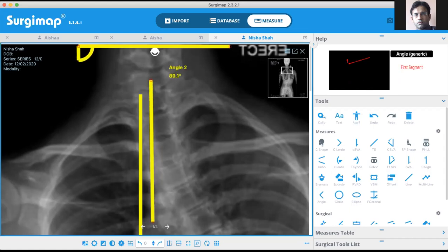So here it's good. You can use the minimap to go down. Don't click, use the minimap to go down. Yeah, one good thing that I'm seeing is that it's showing the live angle also. So basically, let me.